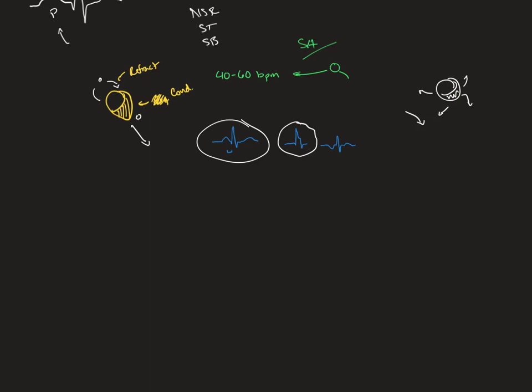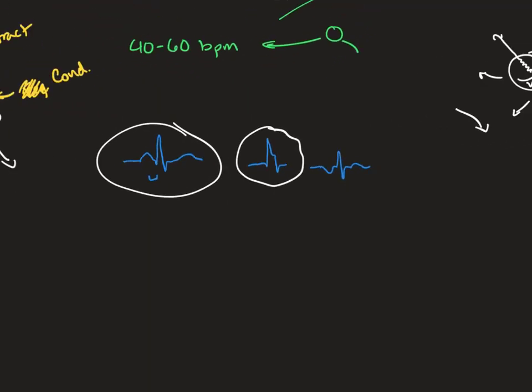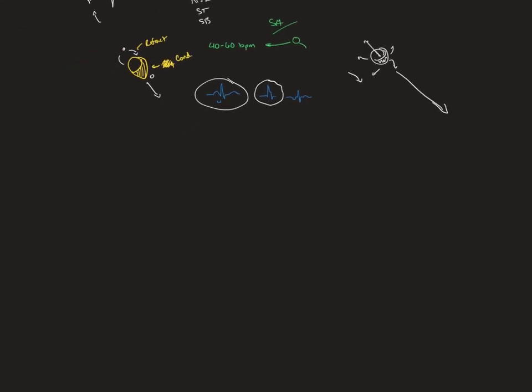But this is still a refractory part of the AV node, which can cause some delay, which is why you could still have a positively deflected P wave, but it's just buried in the QRS, because the atria will depolarize in this case, but it's going to happen while predominantly the electricity is moving down the bundle of His and the bundle branches. That's why that might happen.